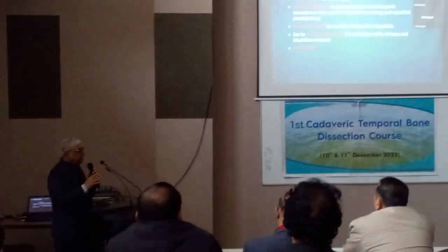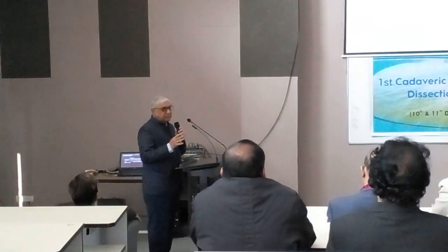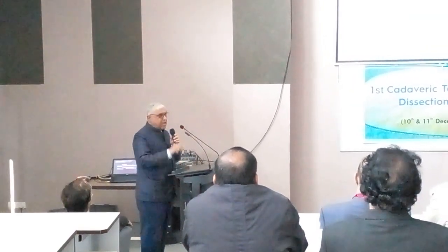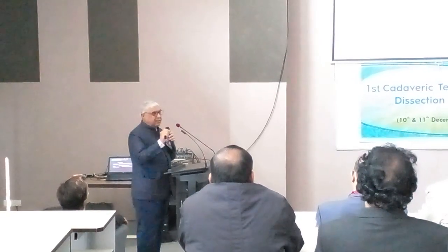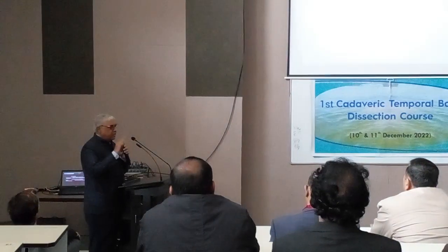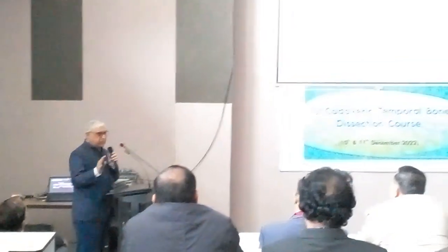You find the tympanic plexus. So identify the tympanic plexus and just cauterize it, or with the help of any sickle knife or anything, you can ablate it. So that is tympanic neurectomy.